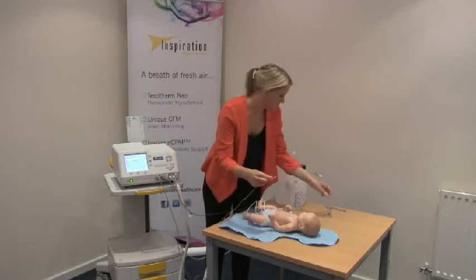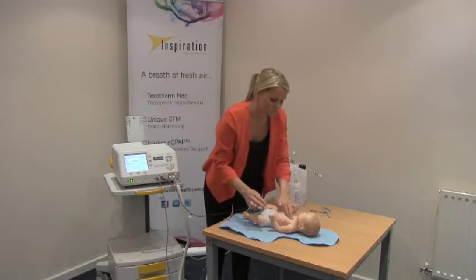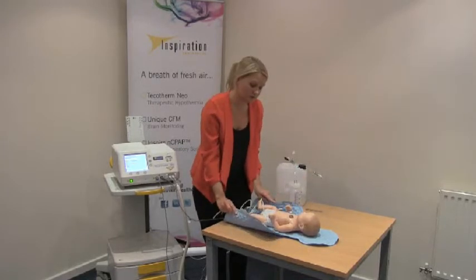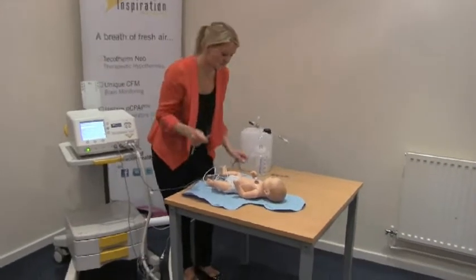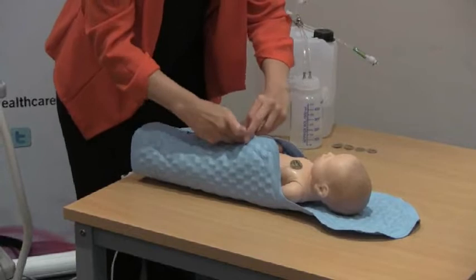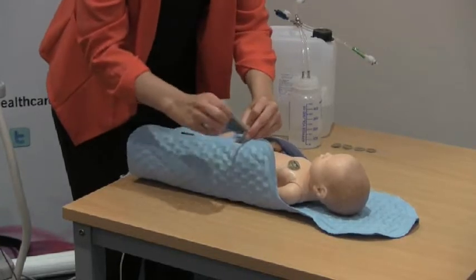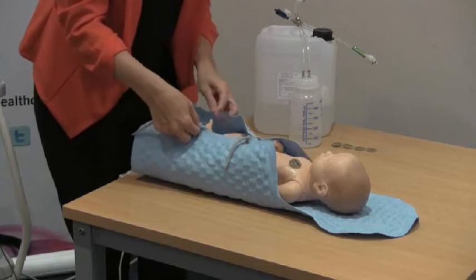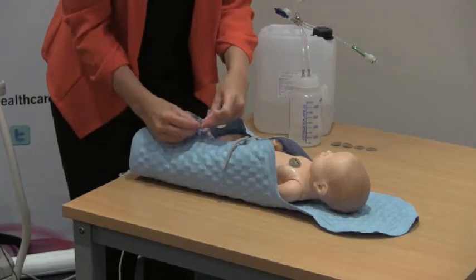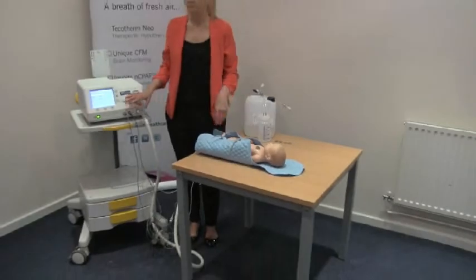The skin probe can be secured with a little temperature sensor cushion. What we need to do is wrap the baby in the mattress just using our felt ties. Wrapping the baby increases the surface area that you're cooling and just allows you to cool down quicker. And now your baby is ready for cooling.